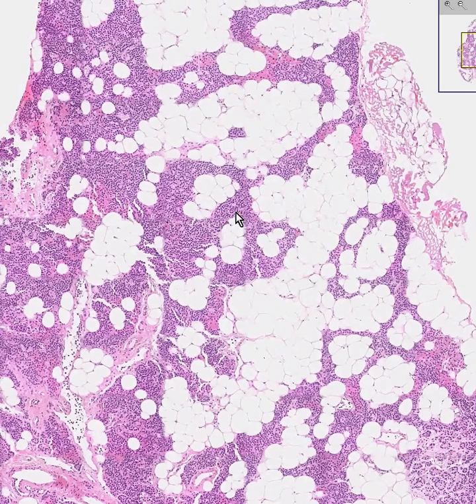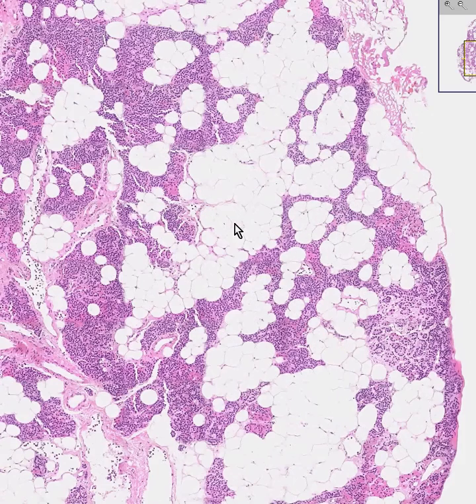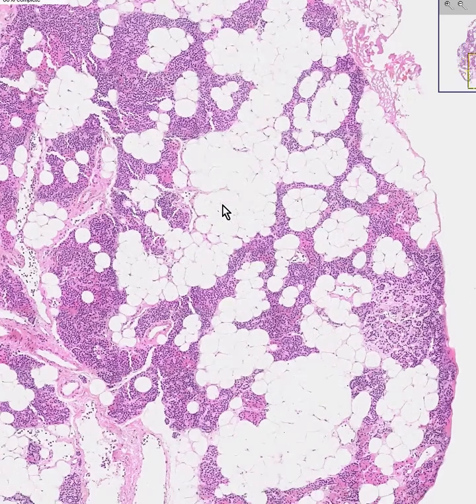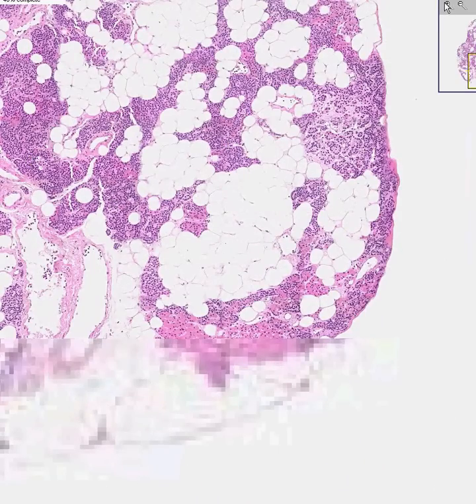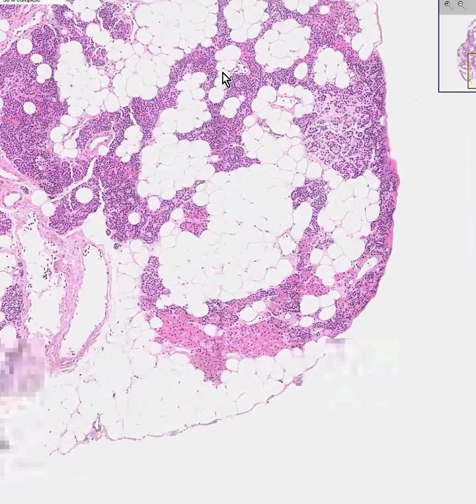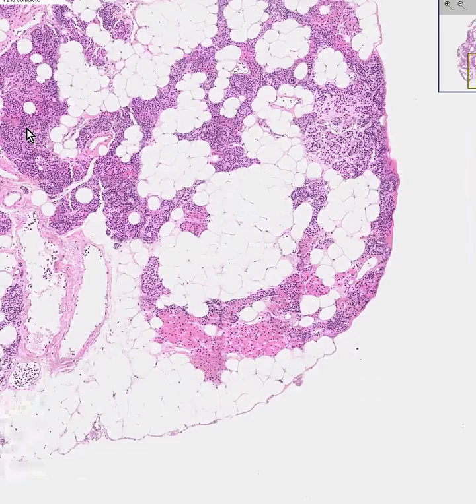The cells that you see chiefly are called chief cells. All of these cells here, which look like endocrine cells, perhaps sometimes looking like they form little follicles — the chief cell of the parathyroid is the chief cell.